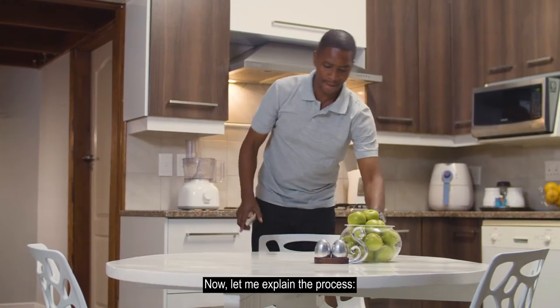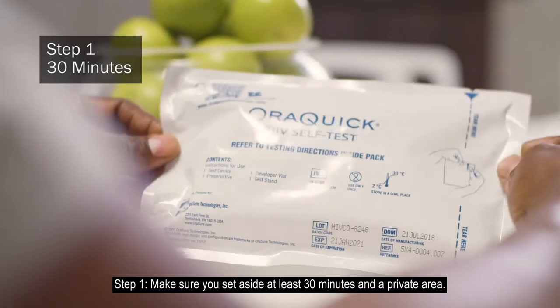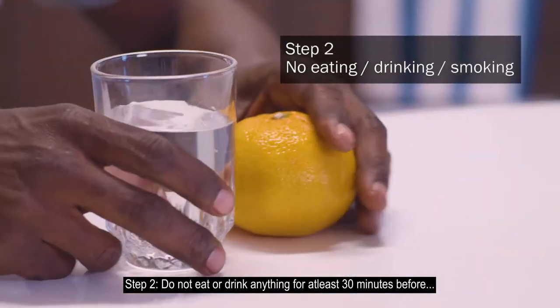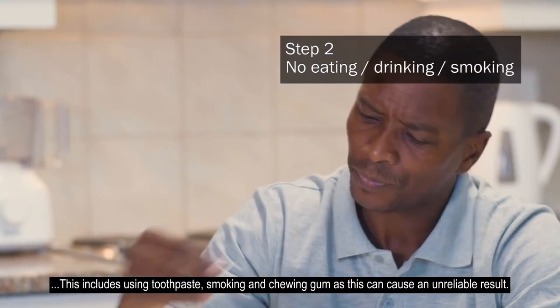Now, let me explain the process. Step 1: Make sure you set aside at least 30 minutes in a private area. Step 2: Do not eat or drink anything for at least 30 minutes before. This includes using toothpaste, smoking, and chewing gum, as this can cause an unreliable result.